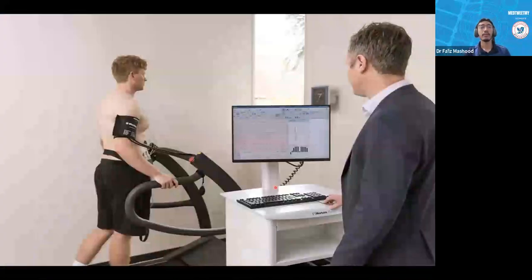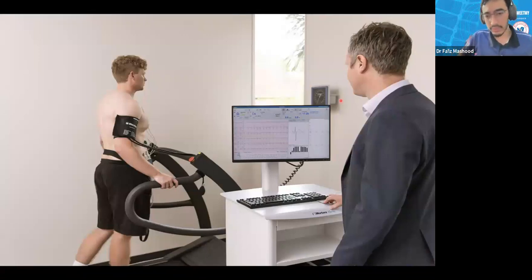So I think this picture summarizes everything about EST. We have our patient there, we have our blood pressure cuff and vital sign monitoring, and we have our chest ECG leads attached on the chest of our patient. We have the monitor there to trace the ECG, and we have our handsome physician, cardiologist or non-cardiologist, here to interpret the EST and ready to refer to a nearby cardiologist.